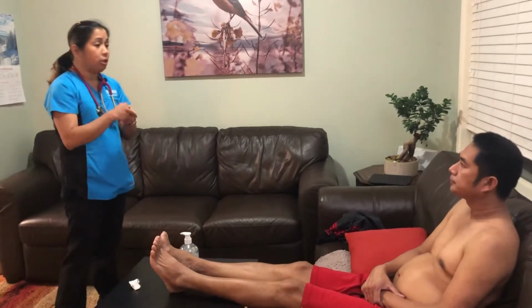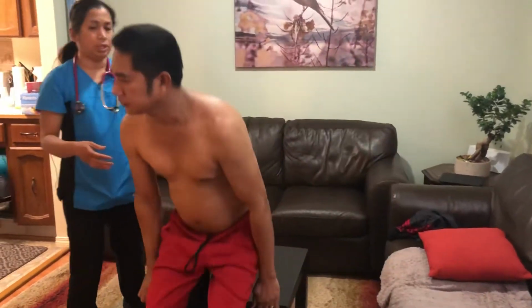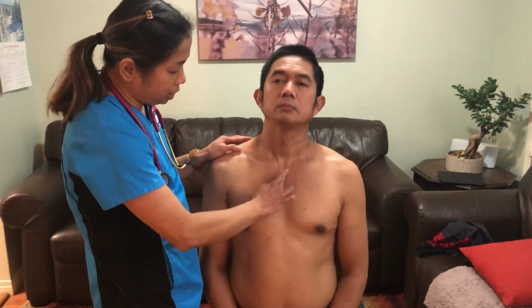Now I'm going to auscultate your heart sounds. Is that okay? Yes, ma'am. Can you sit down here, please? Thank you. The areas are the aortic valve, then the pulmonic, then the tricuspid, and then the mitral. The first is the aortic valve, located in the right second intercostal space, right side of the sternum, from the sternal notch going down.